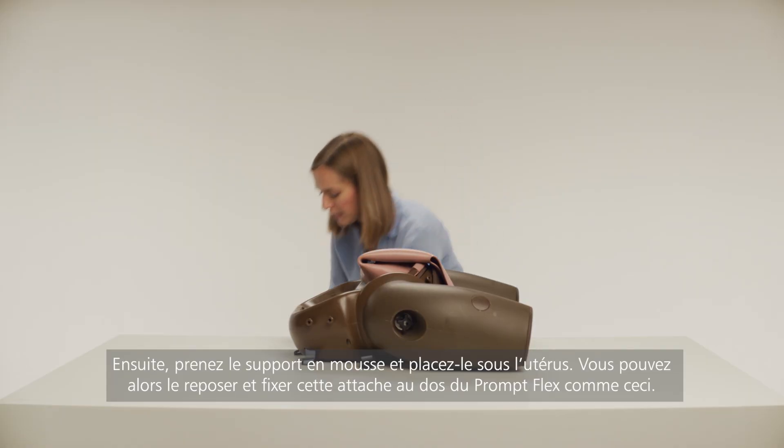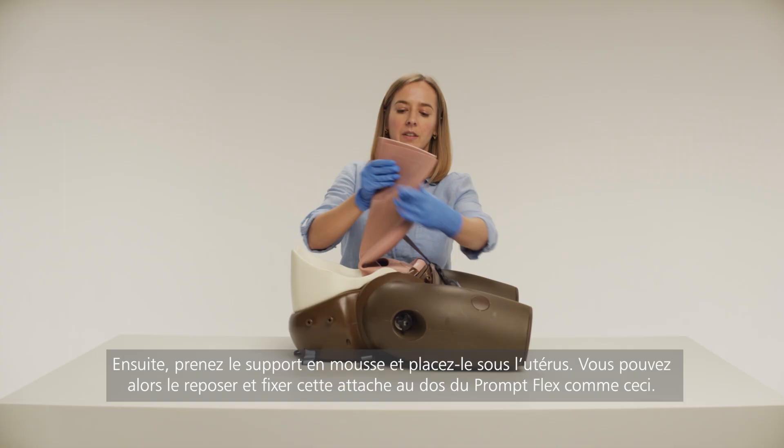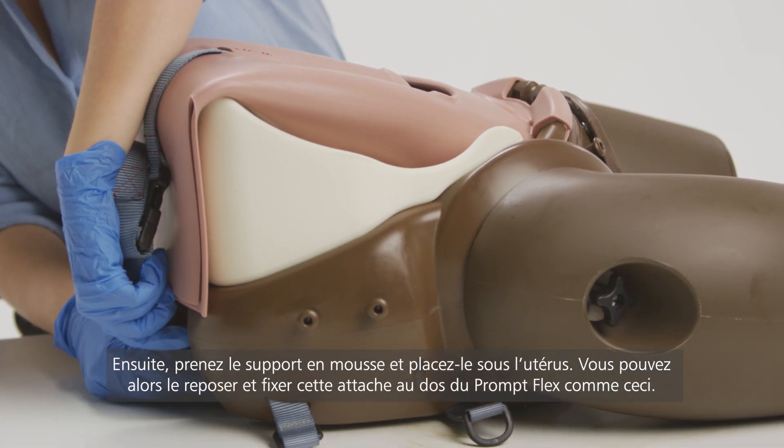Following that, take the foam support and place it underneath the uterus. You can then lie this back and attach this clamp to the back of the PromFlex, like so.